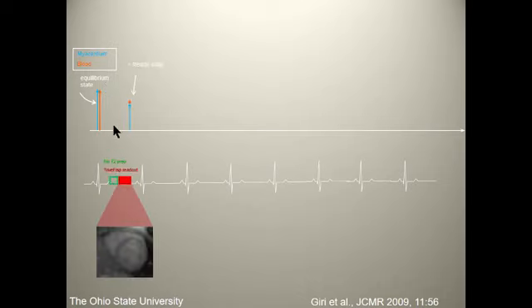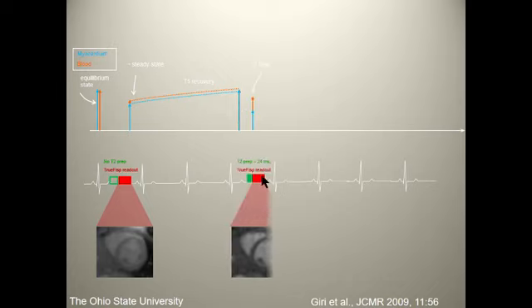And then we've got a cardiac gated T2 prep interval, no T2 prep in this case, sorry, and a single shot SSFP. Wait again for the magnetization to get to a steady state. And then we run with a T2 prep of 24 milliseconds and collect another single shot image. Wait to get to steady state and do the same again.